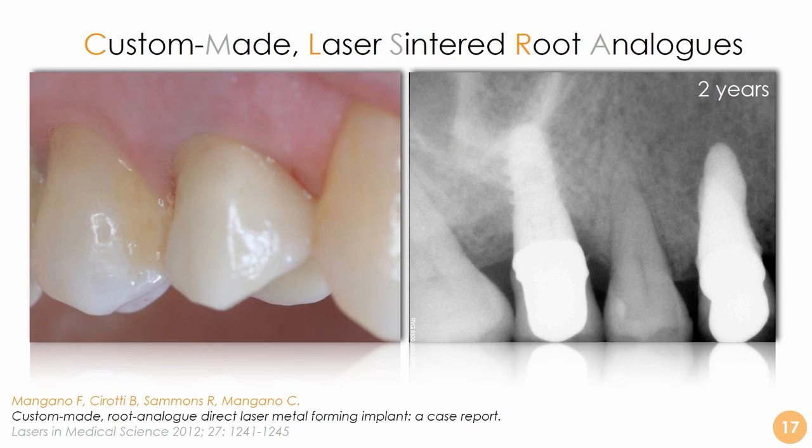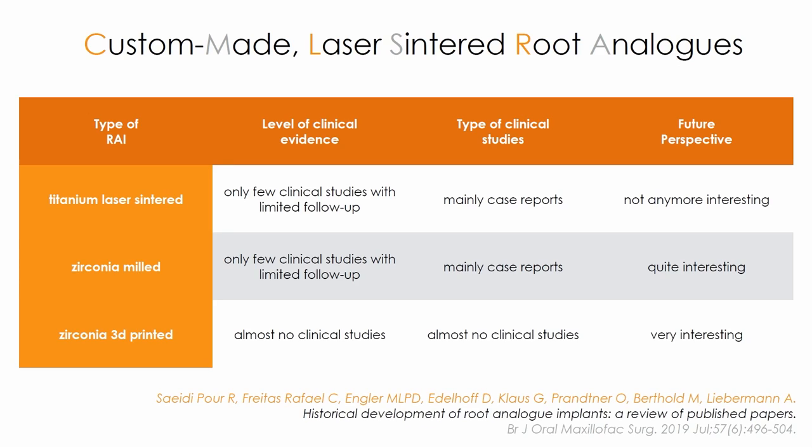And this is the control. These cases were made by Dr. Bruno Cirotti, and we published it together in Lasers in Medical Science in 2012. In that period we were trying to experiment with different kinds of these implants, and they worked quite well clinically, as you can see. But after all, if you look at it in perspective, yes, probably we don't have sufficient evidence to support the concept of custom-made laser sintered root analog in titanium now.